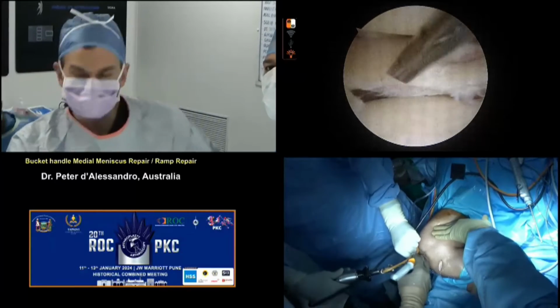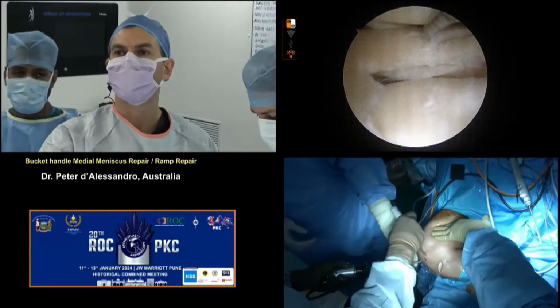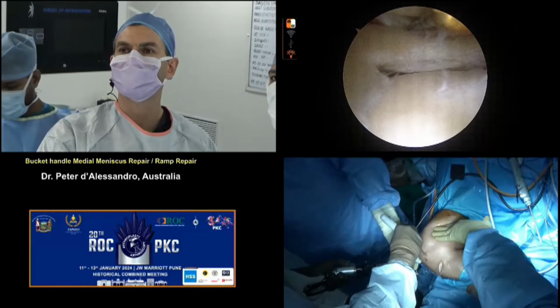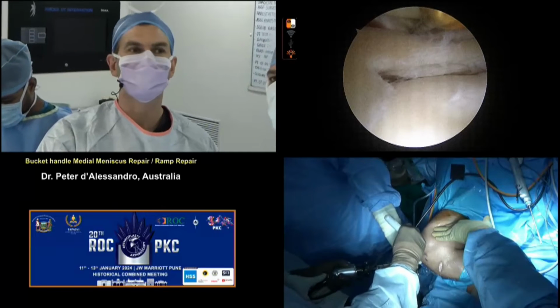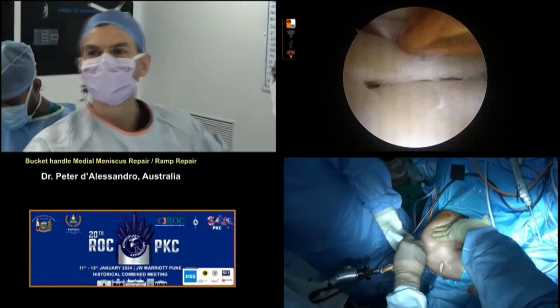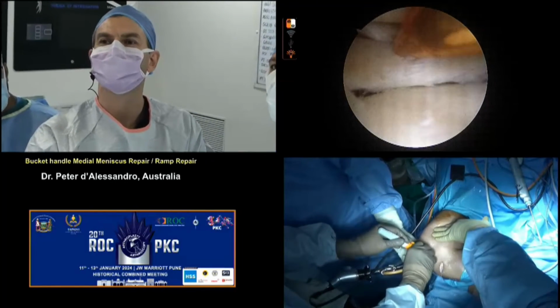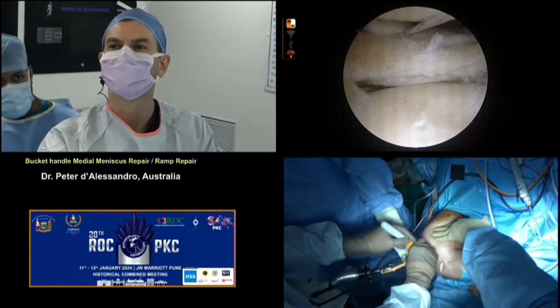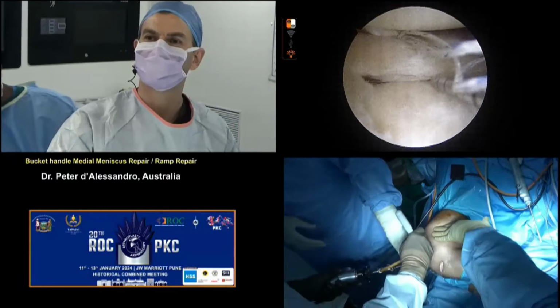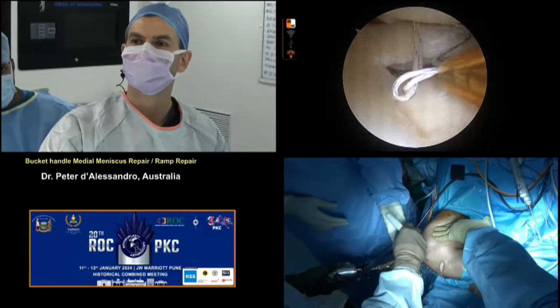I mentioned blood clot. Certainly we're doing more and more blood clot augmentation, and I think it's worth considering. Now, I'm going to put this into the popliteus here. I'd like the panel to tell me whether they think that's a good or a bad idea. That's ouch to me. So how do your patients feel? You throw this fast-fix into their popliteus. How do they feel in the next 3 months, 6 months, 9 months as they return to play? Do they feel that pop in the back of their knee?